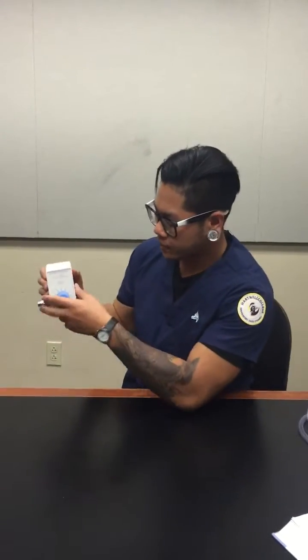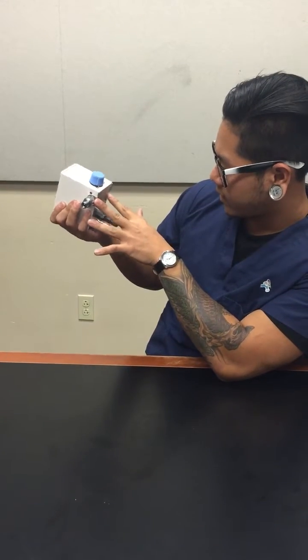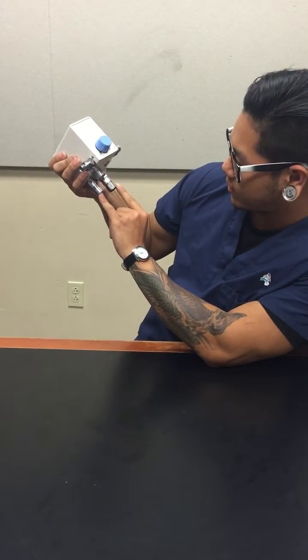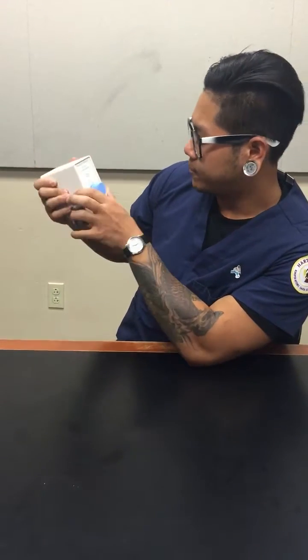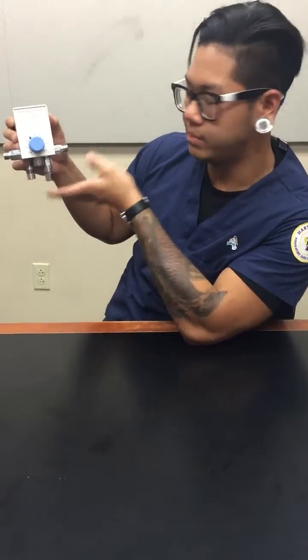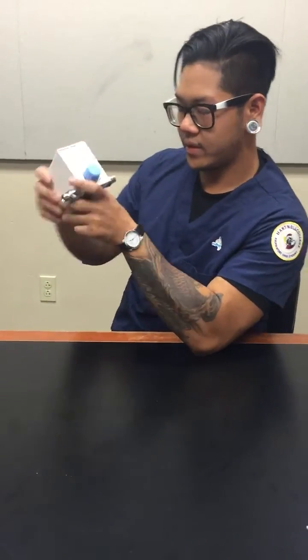So I'm gonna show you how to use it, or what it is basically. So you're gonna have it sideways, and you can have 2 Thorpe tubes and flow meters, and you connect them to here. And yeah, so basically you can have your air and oxygen right here on the sides, and then this is where it's going to connect to the wall outlet for medical air inlet or oxygen inlet. So yeah, and then you can change your FiO2 from 21 to 100. You can also, as soon as you put your flow meter on, add a bubble humidifier and stuff like that. So yeah, I think that's it.